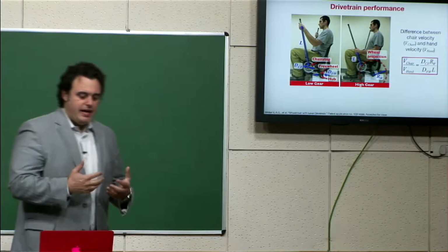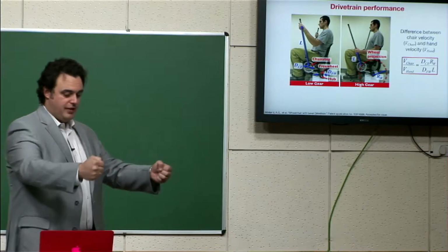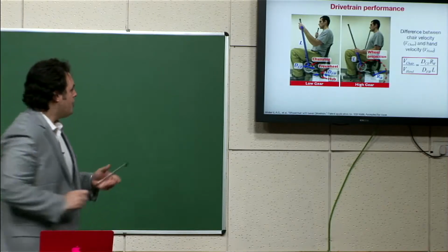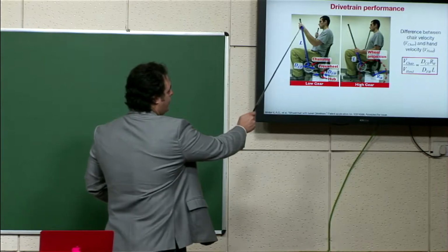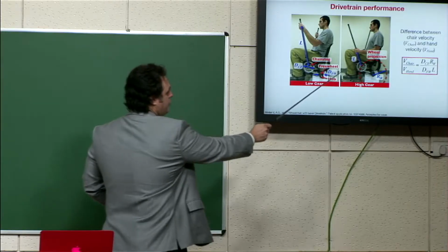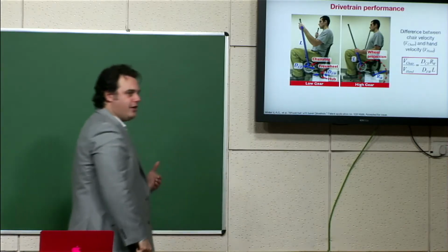And the big innovation behind our drivetrain, what we realized, is that we could have a lever system where you grab a set of levers and you can change your mechanical advantage by just changing your hand position on the levers. So this would be a low gear situation where you produce a lot of torque on the lever because you grab high on it and you have this whole lever length L. And this would be the high speed, high gear situation where you have a smaller lever length, but you can push through a bigger angle every time you push to create a higher angular velocity.